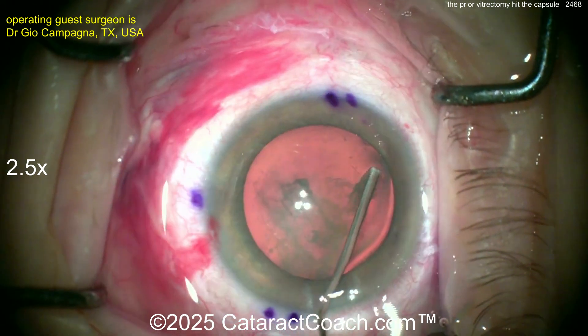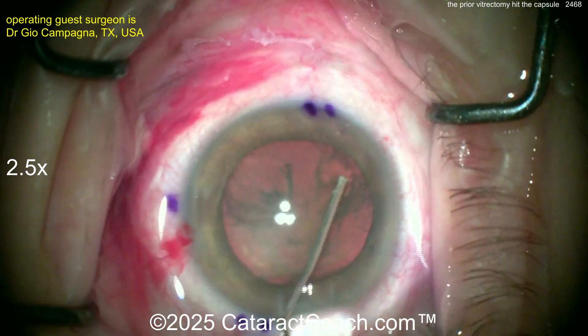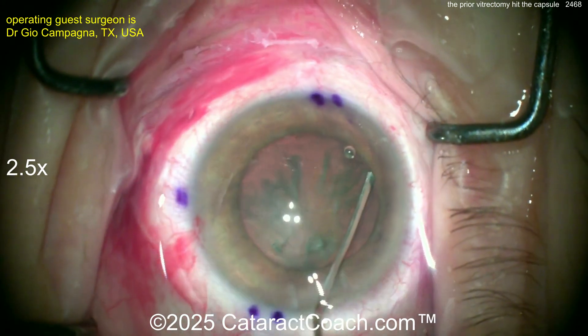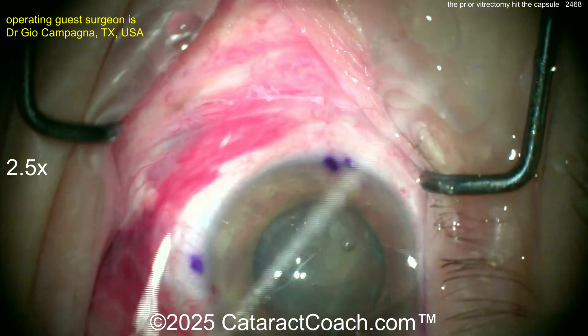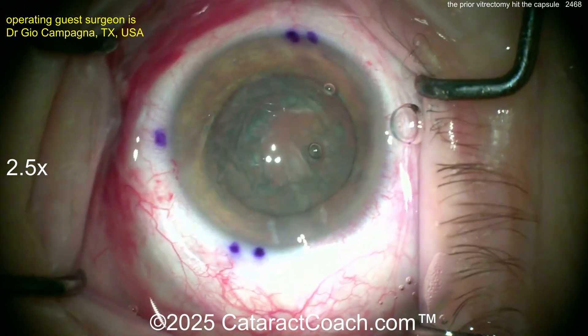Watch the hydrodissection carefully — here's where you can get in trouble. Slow, slow, slow. You really got to treat this basically like a posterior polar because the capsule, where it was hit by the trocar, is for sure damaged. It's for sure weak — it may just rip open. You don't know. Hopefully there was some fibrosis or healing of it afterwards, so it's not so weak. The lens is rotating, and it doesn't look like the capsule blew out, at least not yet.